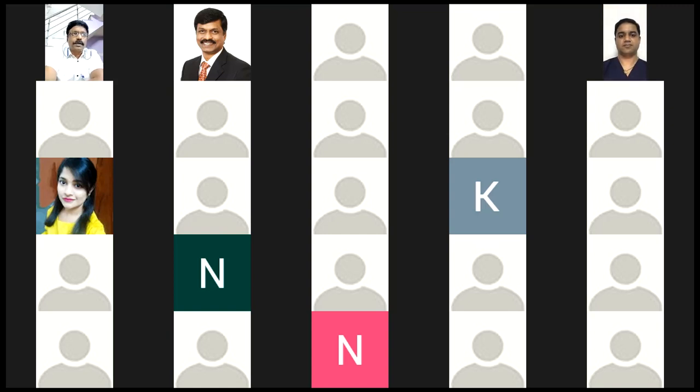Okay. Thank you, sir. Do you use a longer needle or a shorter one? For the nerve stimulator, a 5 centimeter needle will suffice. A 15 centimeter needle is a bit longer, and you should be very careful. Yeah, 5 centimeters.